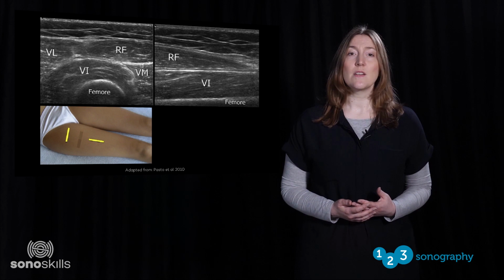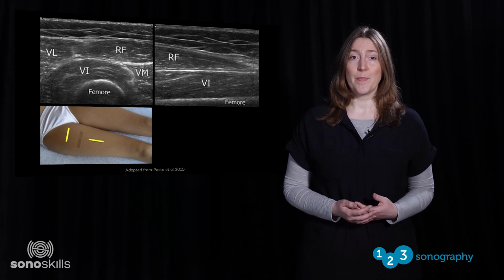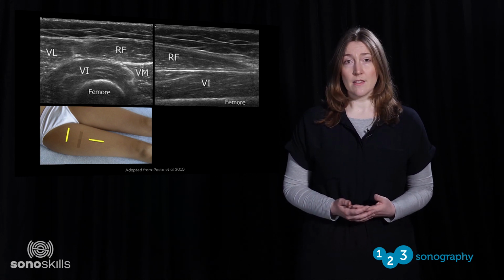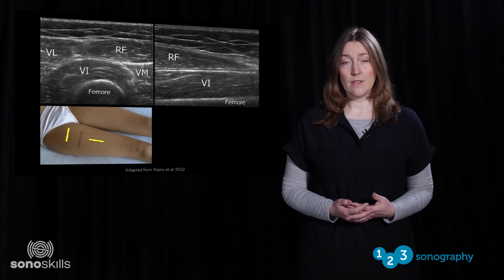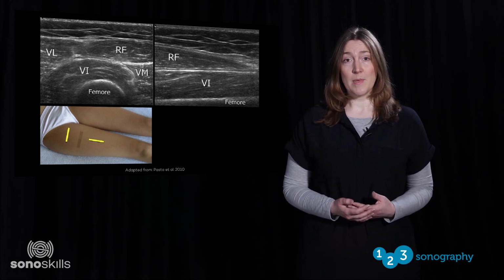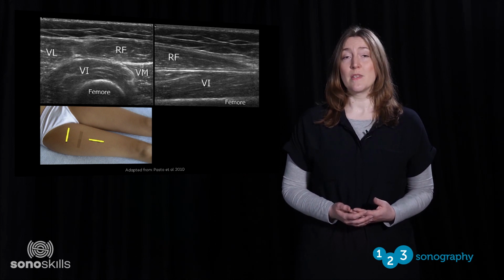You can see the internal muscle architecture of muscle fibres and peri and endomysium. The upper right image has been taken on the most distal indicated transducer position. You can see a longitudinal scan of the rectus femoris muscle with the underlying vastus intermedius. Please note the long muscle fibres in both muscles.